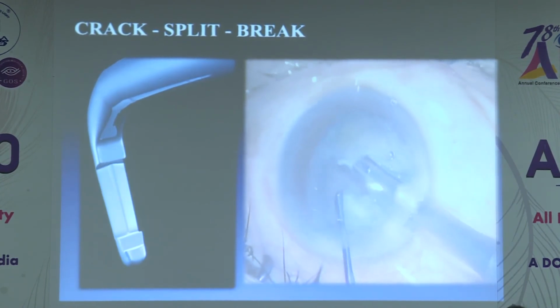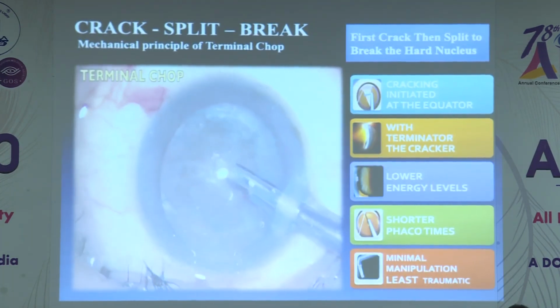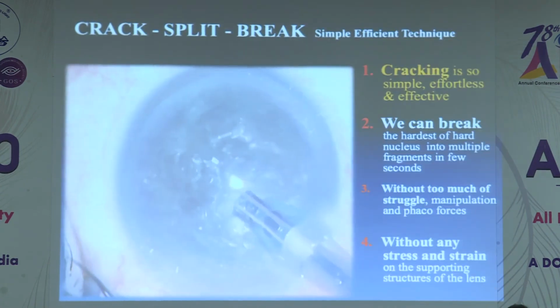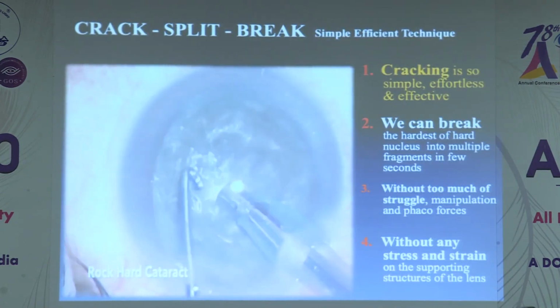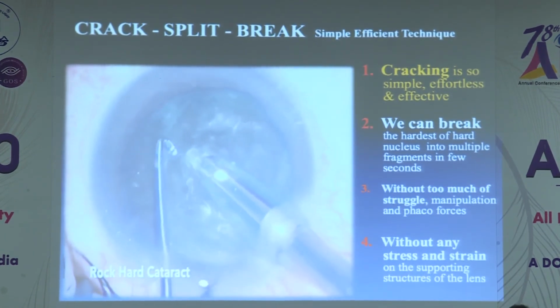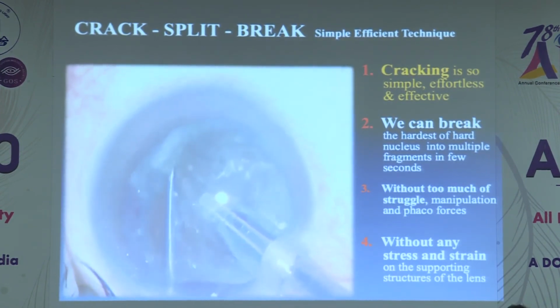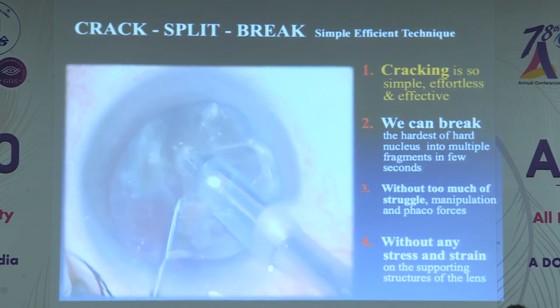So this is how you can crack. Why you get a beautiful crack is because you are working at the equator. You're not working at the center of the nucleus, you are working at the equator. If you work at the equator, the weakest part of the nucleus, you can hook it around and crack. I'll show you a little harder cataract. You can see this is almost a grade 6 or grade 7 cataract, and even this kind of cataract you can break so simply. You just hook it under visualization and you crack it.